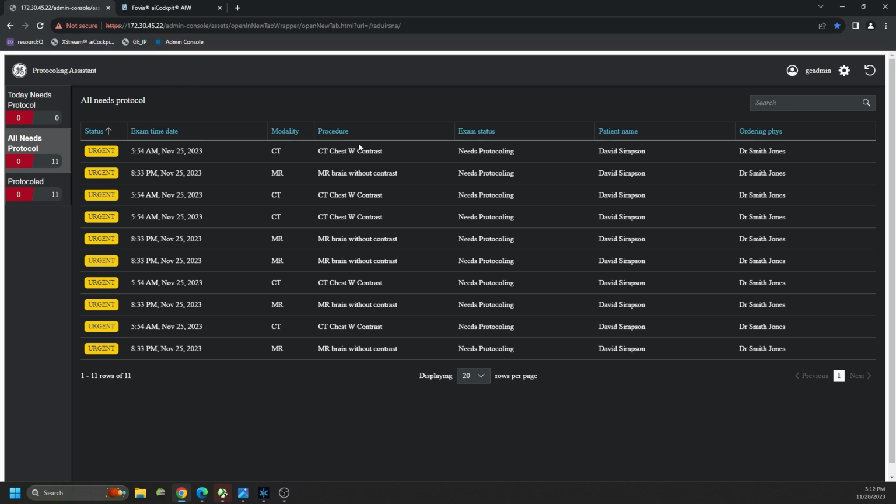If you're a resident or have ever been a resident before, protocoling isn't the most exciting work for us. Here is what AI can offer to this tedious job.